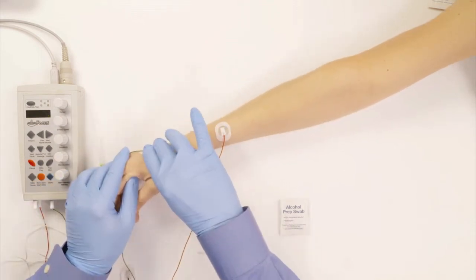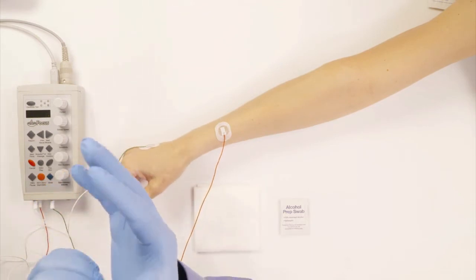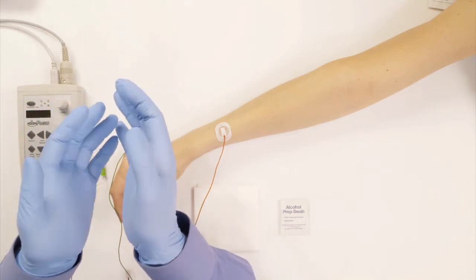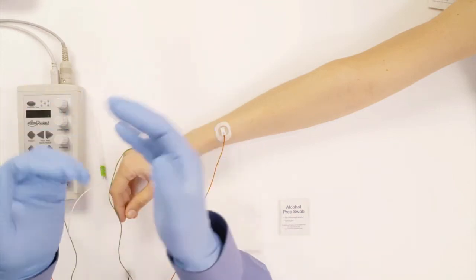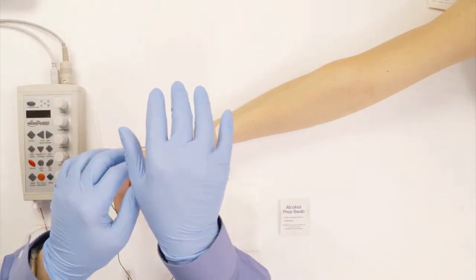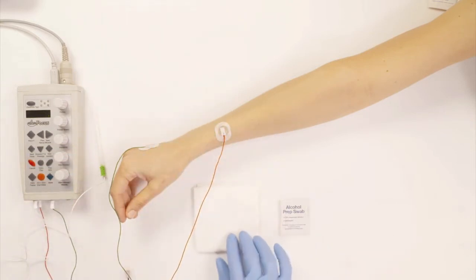Now you will notice, obviously, that I'm wearing gloves. And the reason we do that is to protect yourself from the patient and protect the patient from you because whenever you're doing needle insertion, you might actually draw some blood. And that's the reason you want to protect yourself from the patient and you want to protect the patient from you.